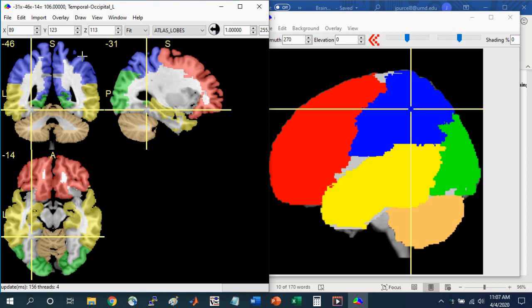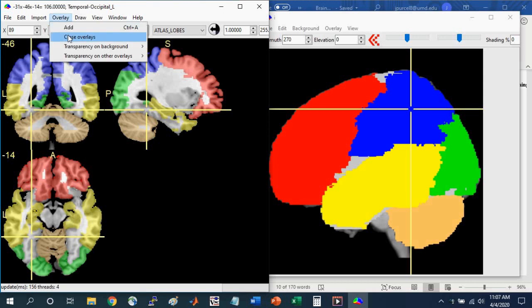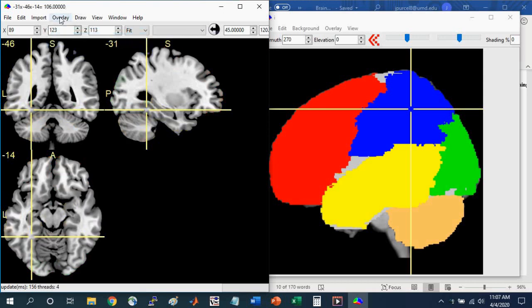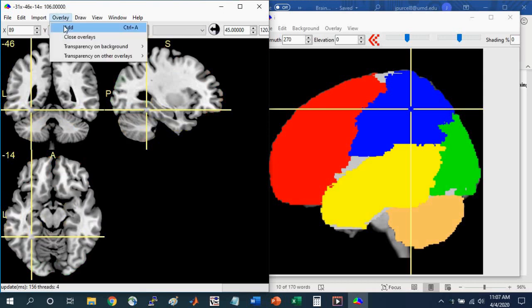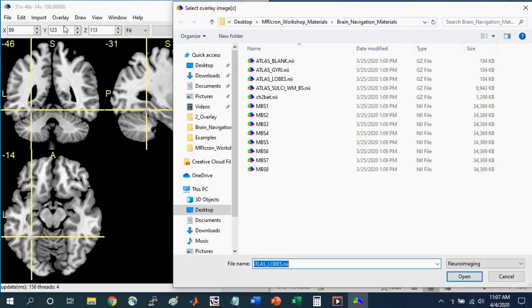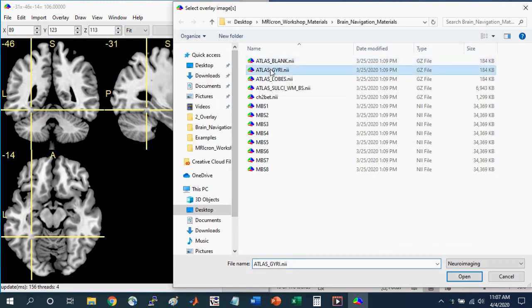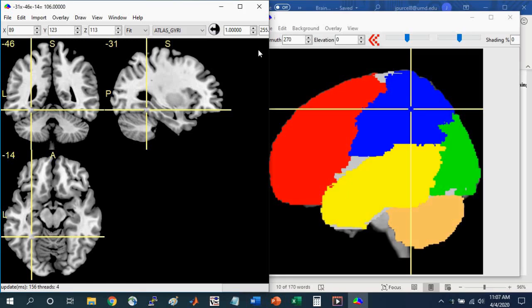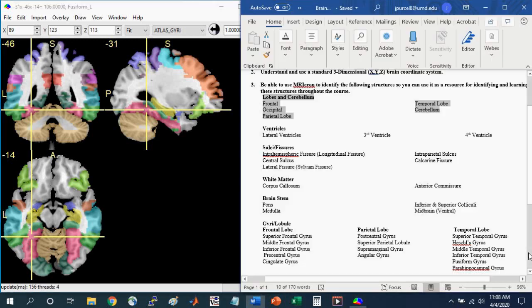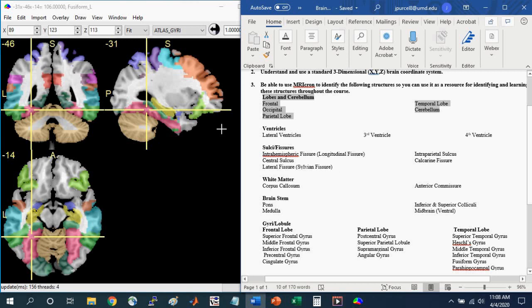Next we can look at a more detailed atlas. To do that, first close the atlas that you have. Go to Overlay, Close Overlays, and then go to Overlay, Add. Now we're going to select the atlas gyri, Open. Now you'll see much more detail to these structures. There are colors associated with the specific gyri that would be good for you to know. If you go back to the learning guide, you'll see that all the structures that are listed here are colored in the atlases that I've provided.